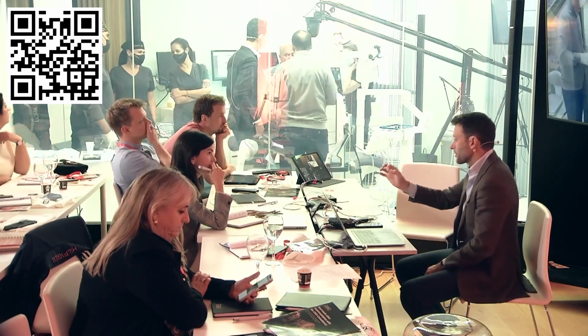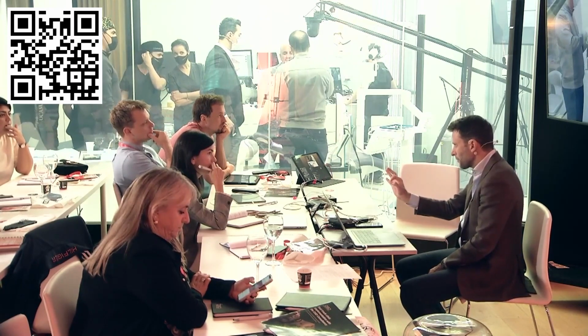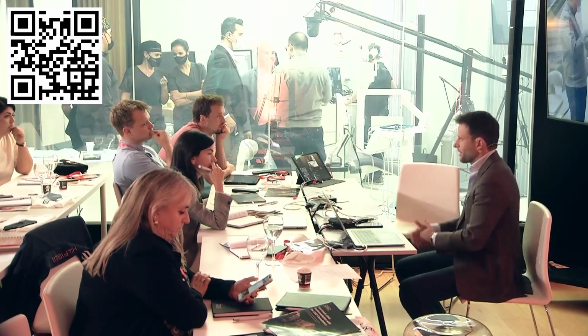What else? For example, if the teeth are short, you can put some flow, check the length, and define the length in the mouth. If you do that, scan again, take the new pictures, and send them back. But it should be pretty close to the provisional that you just delivered, right? This should be pretty close.